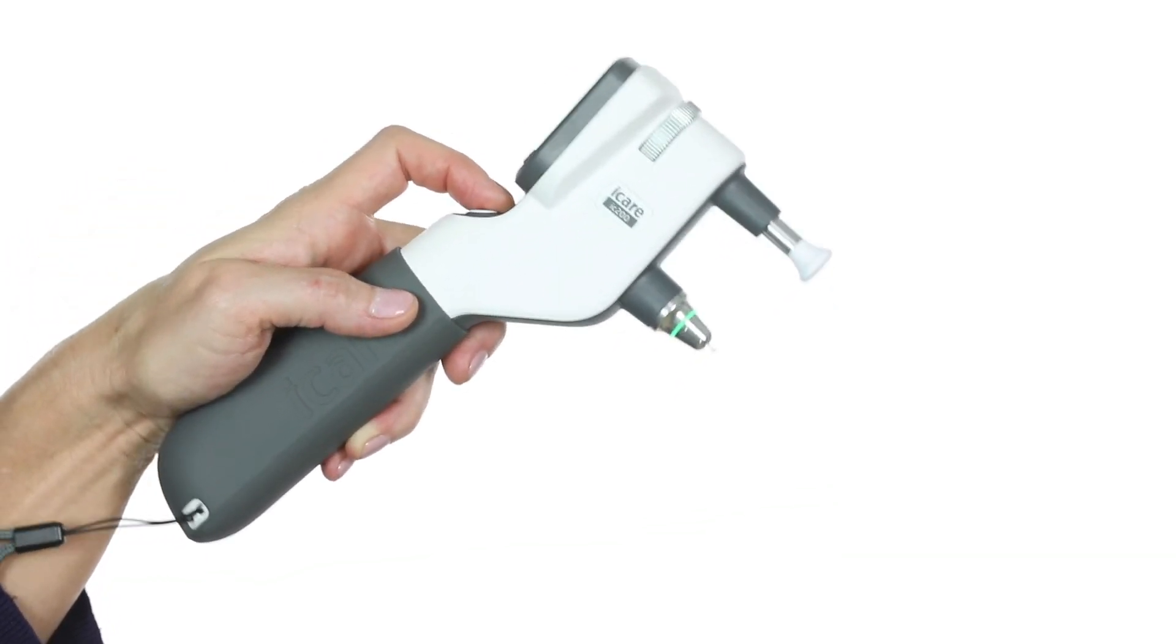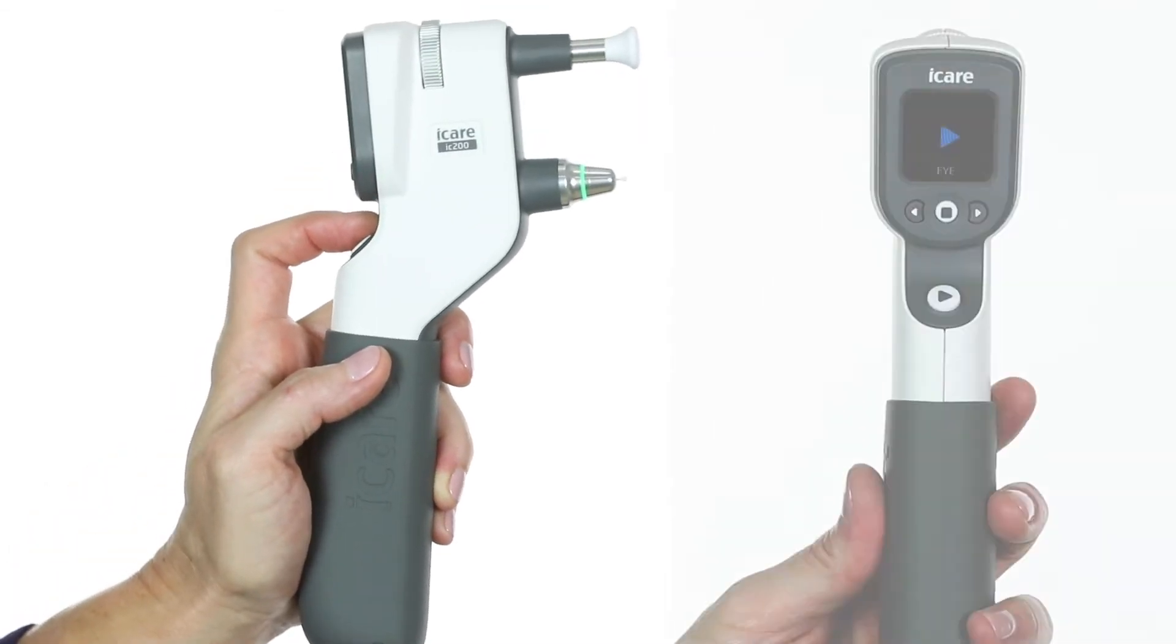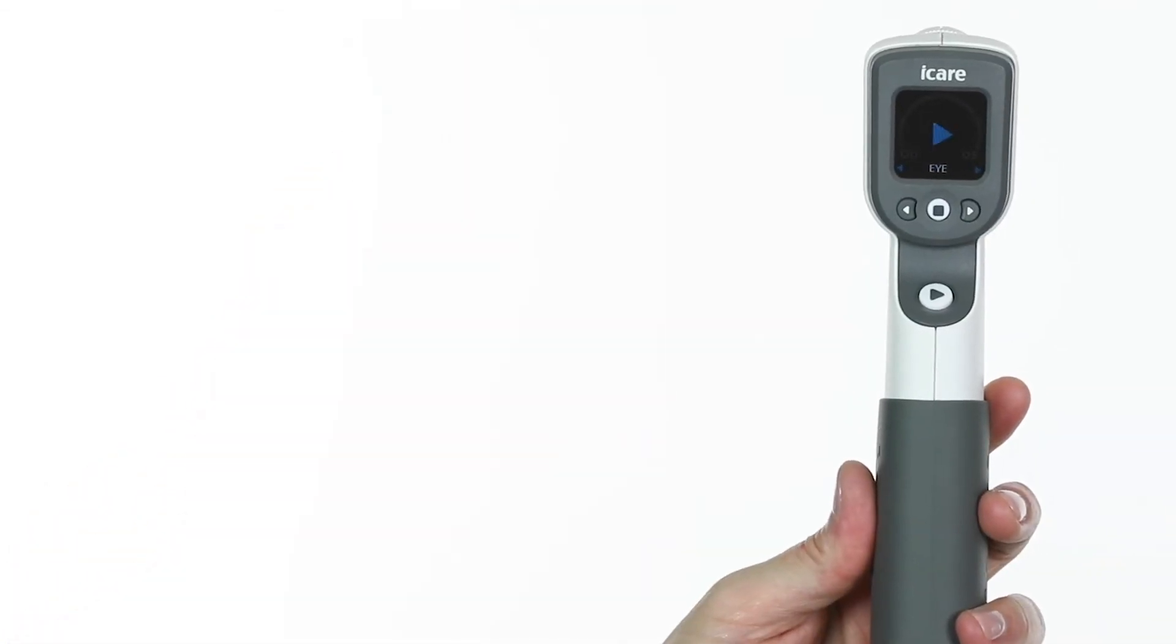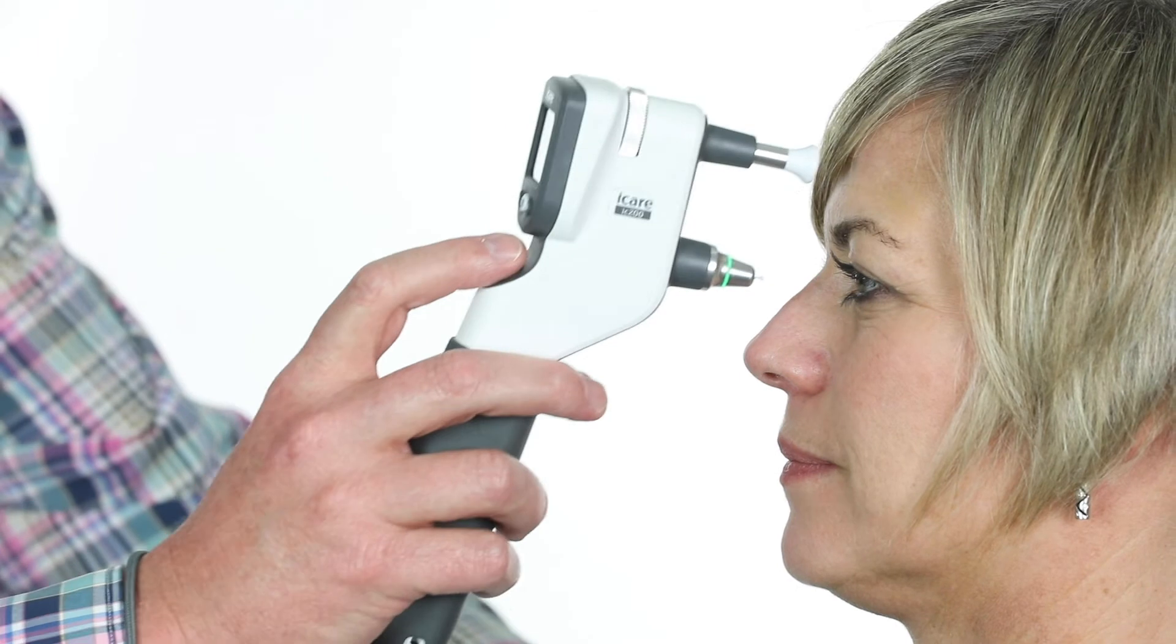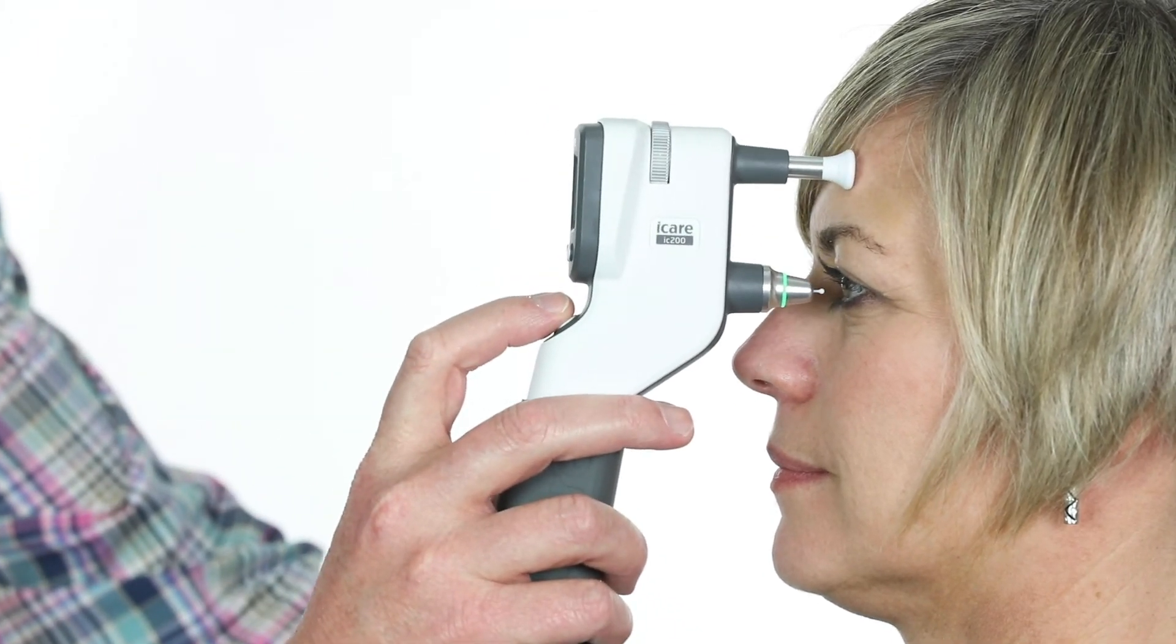The tonometer is ready to take a measurement when the blue play symbol appears. Place the forehead support on the patient's forehead. Aim the probe in the center of eye about 5 millimeters away and perpendicular to the cornea.